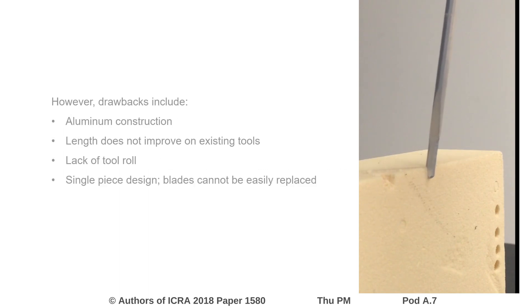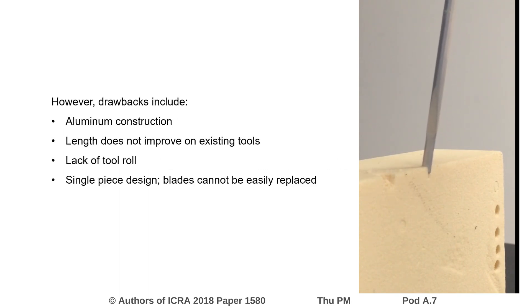However, as an initial prototype there are significant drawbacks. These include the aluminum construction which results in significant blade wear and low amplitude, a length that does not yet improve on existing systems, a lack of tool roll built into the mounting system, and a single-piece design in which components cannot be replaced.